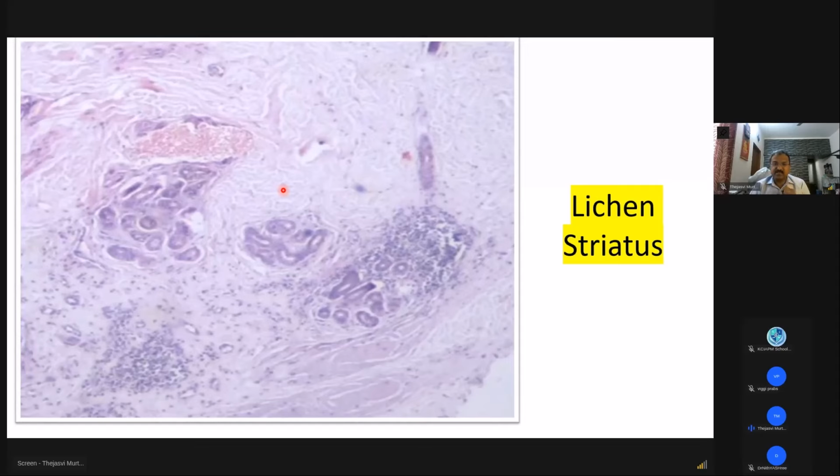Here also clinical details become important because lichen striatus lesions are linear, and they are distributed along the dermatomes. So wherever clinical details are important, I'll be reiterating, and you can carefully note them down. So lichen striatus will be in the papillary dermis and perieccrine. Lichen nitidus, papillary dermis restricted to one or two papillae.